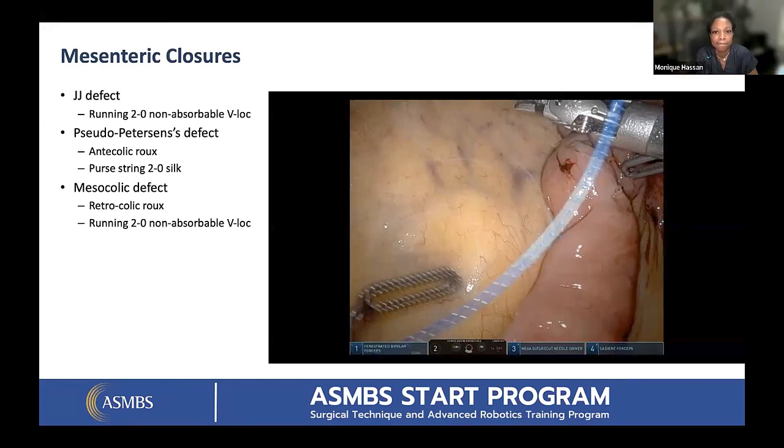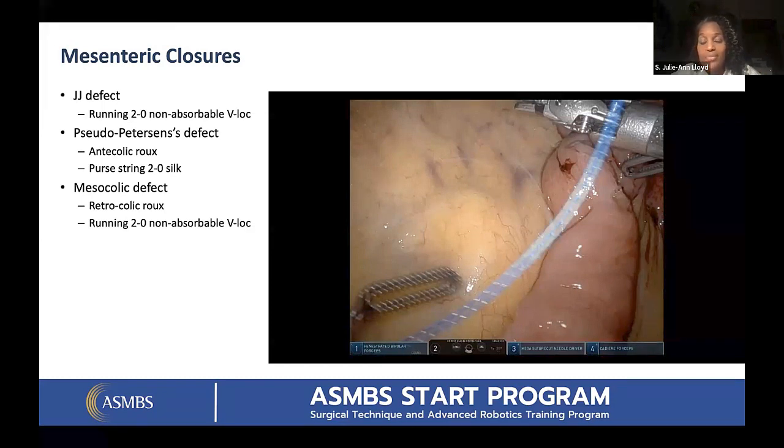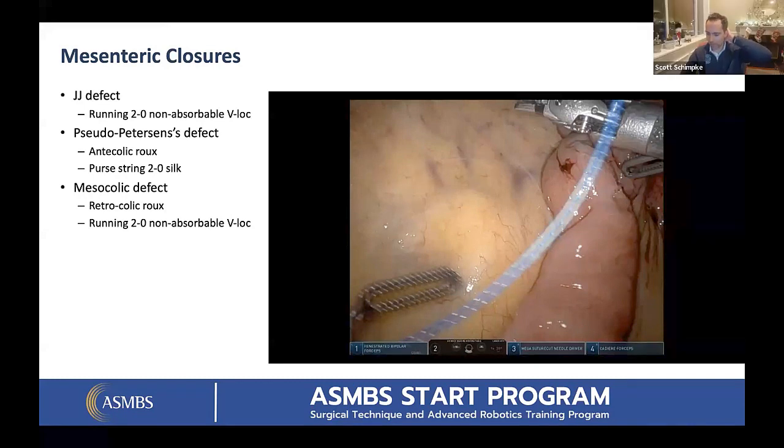So we do have the Trump, the PF bed or whatever. And so you can see the degree. It's usually somewhere in the 7, 8, 9 degree range. So it is some reverse Trendelenburg, but it's not a lot for me, at least personally. Yeah, I'm like 12 to 15. So I use 12. Yeah, my patients are standing up. I have them at like 20. So yeah, I'm more aggressive with the sleeve for sure, but the bypass not as much.